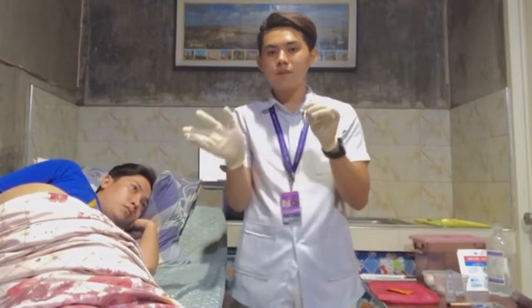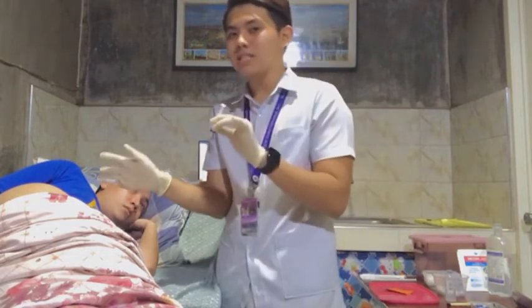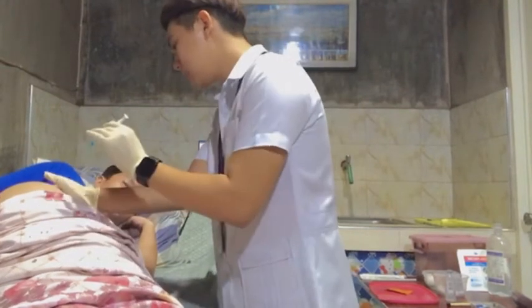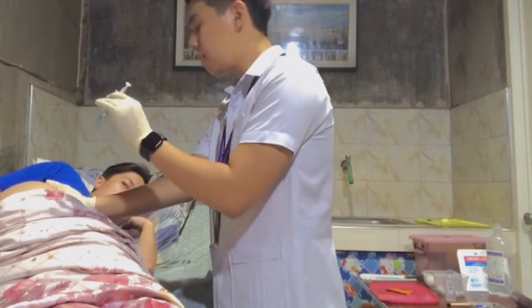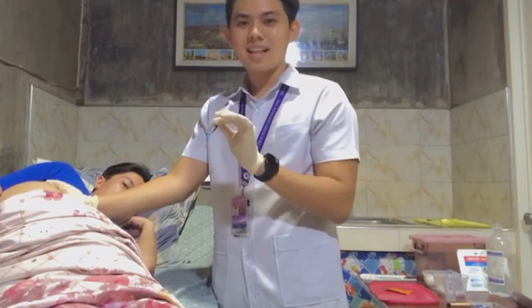After that, place the ulnar side of your non-dominant hand just below the injection site and pull the patient's skin laterally about 1 to 1.5 inches. So just like this, and then just like that. Hold this position until you have inserted the needle.